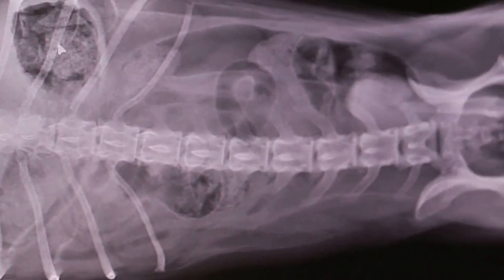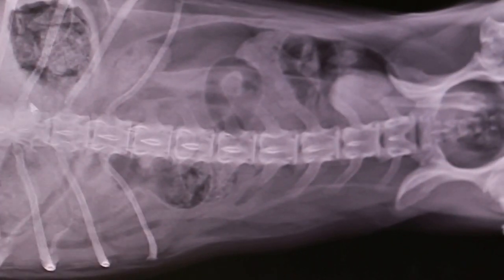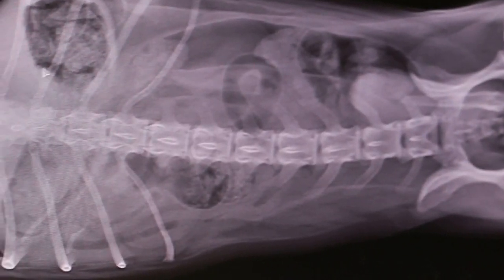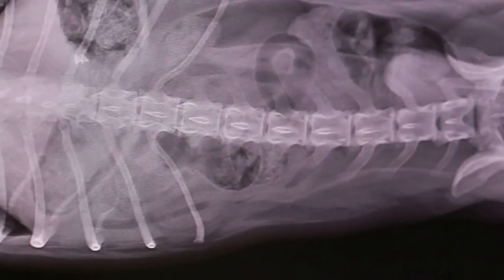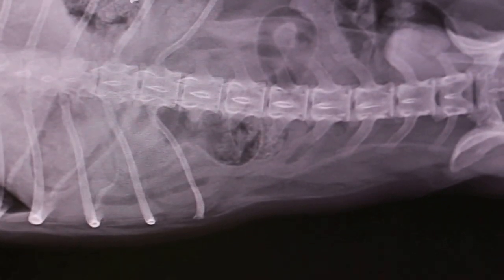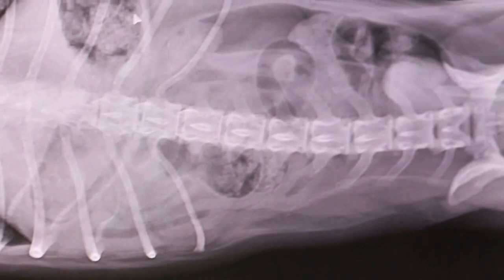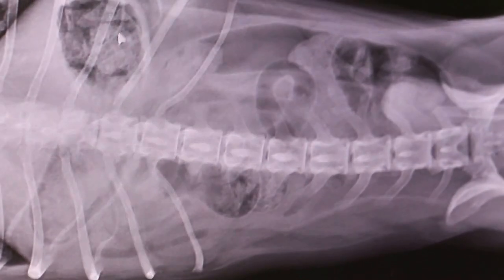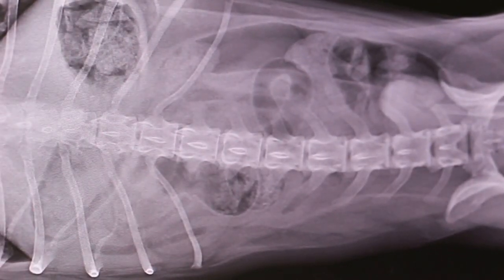So the cat might still be eating. Wait — this one is a dog, not a cat. The dog is still eating — you've got a stomach full of food. Okay, finishing.